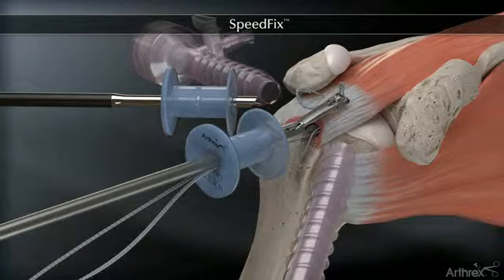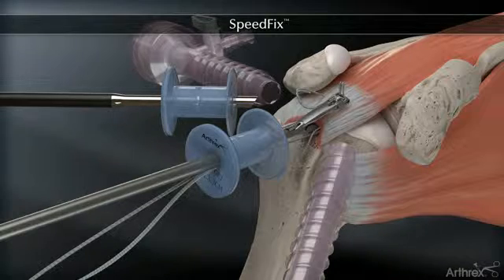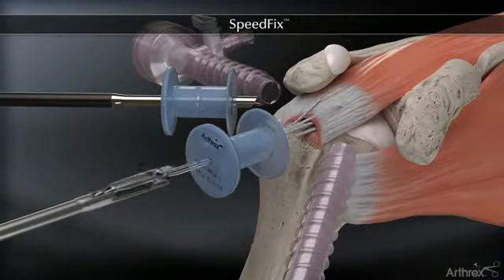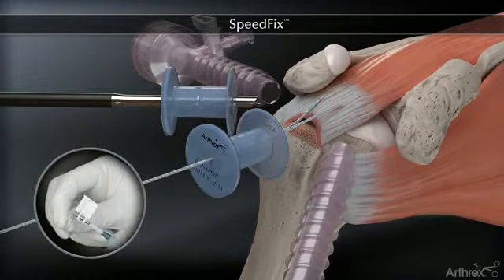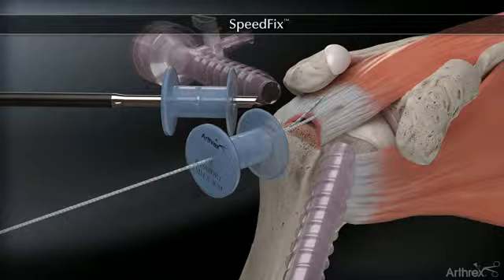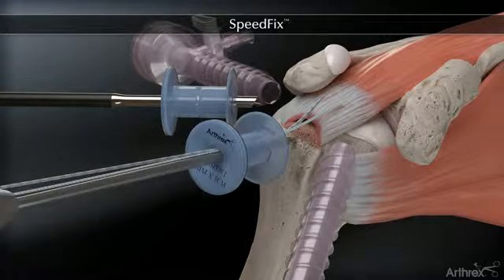The multi-fire fast pass scorpion automatically captures and retrieves both of the fiber tape tails. The fiber tape tails are then pre-loaded through the swivel lock eyelet, and a bone socket is prepared.